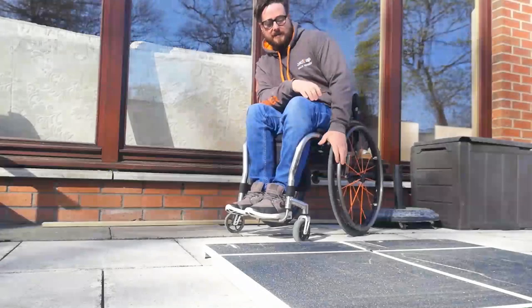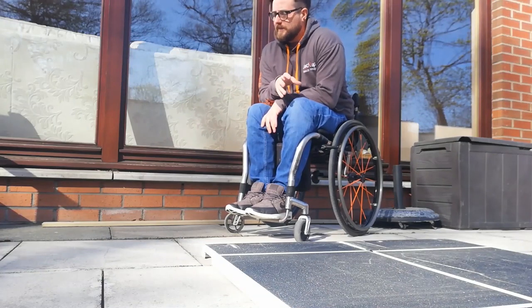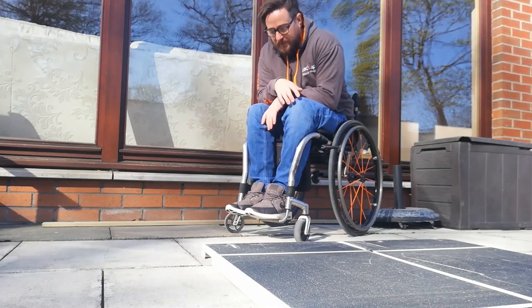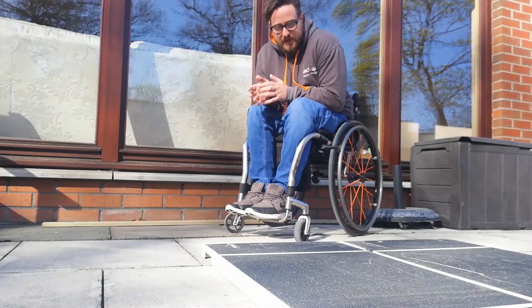Hi guys, it's Rich from Backup here again. I just wanted to use this next little section of video to highlight how we go about getting down kerbs backwards in our wheelchair. An incredibly useful skill to have for when we're getting around and about in the community — you might not have access to a dropped kerb, so it's a good one to be able to master.